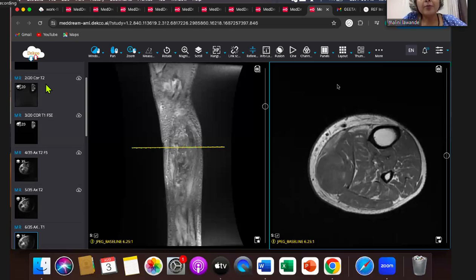And according to me, if the technician, whom you have initially taught, is making a mistake, make them repeat, let them call up the patient, call back, make sure it's done. They'll realize that if you are strict about what you want, you get the sequences. It does take an effort to set it up initially, but a tumor protocol, whether it is a bone tumor or a soft tissue tumor, is quite standard.